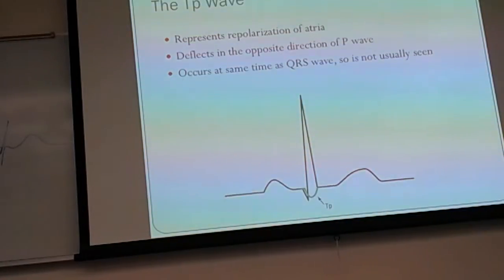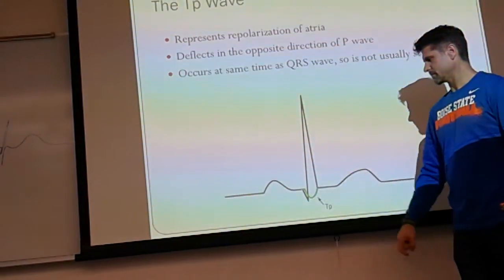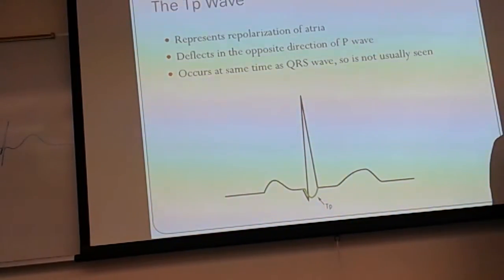Yes, ma'am. I got a question. Is the QRS negative deflection that happens right there, is that the initial part of the TP? No. It's its own complex, and I'll cover it in like 6 minutes, maybe 4.